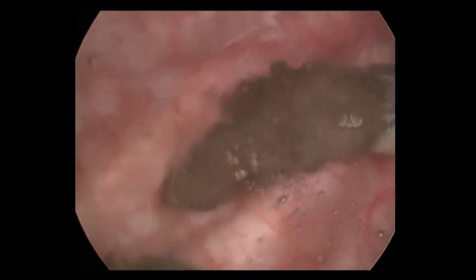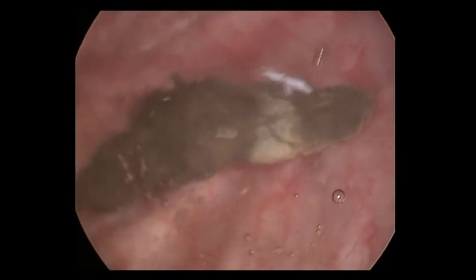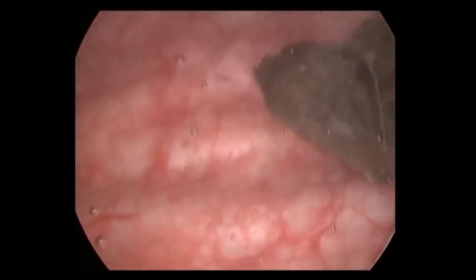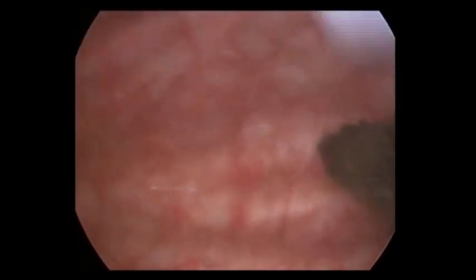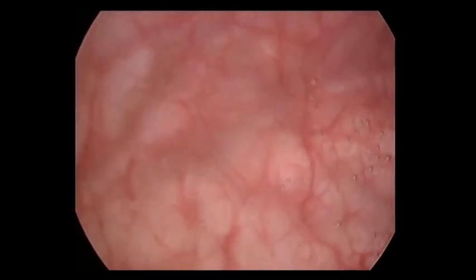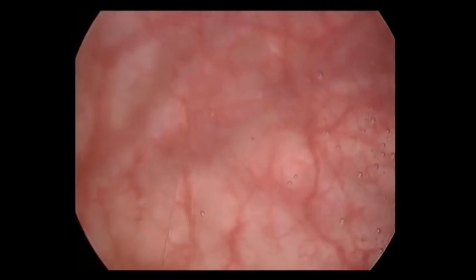Now we are inside the urinary bladder. These are two small bladder calculi — you can see the shape of these two calculi. One is somewhat tubular in nature, which is suggestive of the fact that these stones probably descended from the ureter area through the ureterovesical opening. Here you can also see various features of chronic cystitis, including trabeculations.